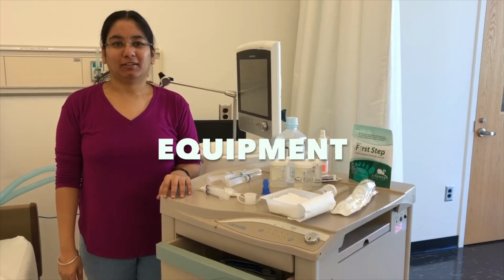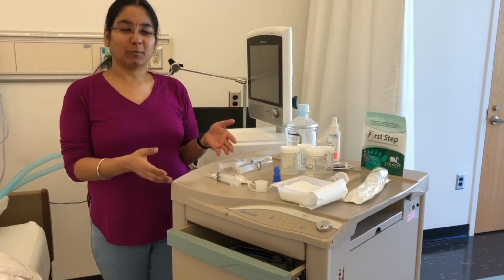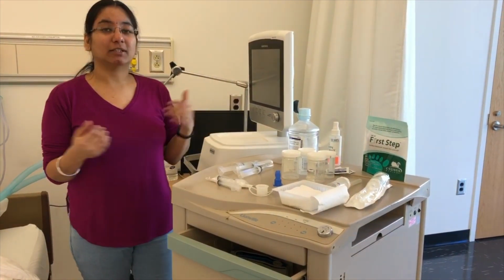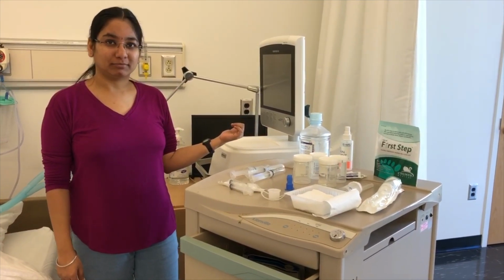So now we'll be discussing the equipment necessary for the bronchoscopy procedure. So we set the equipment on the side of the ventilator so that we can assist the physician and monitor the ventilator settings.